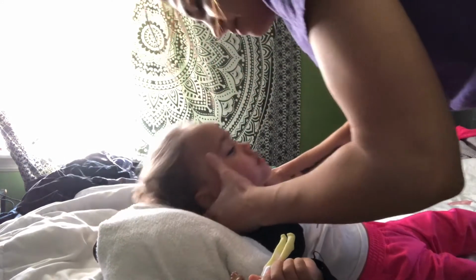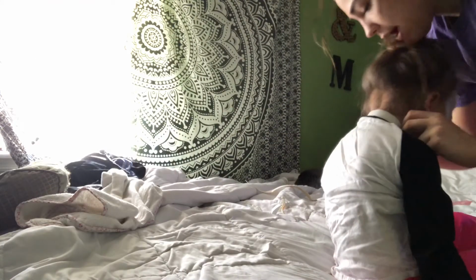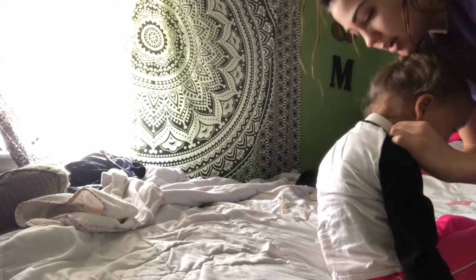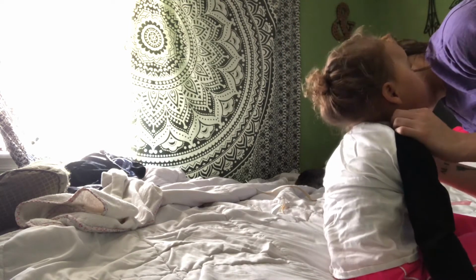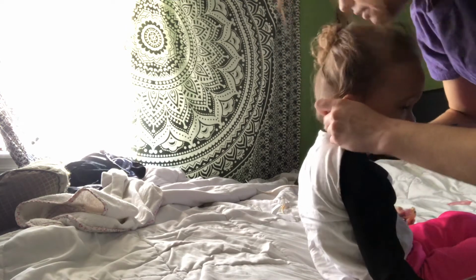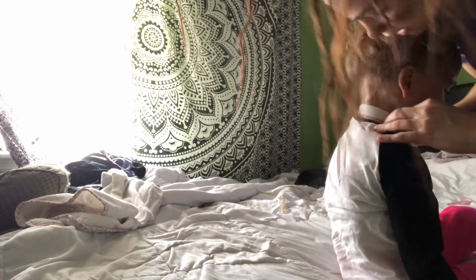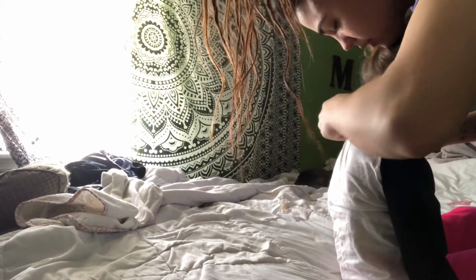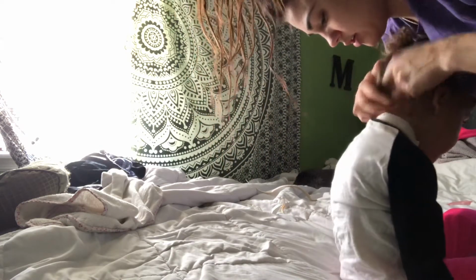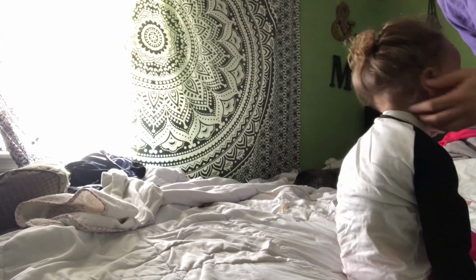Okay, now you sit up, up, up, up. And this is where I can have her look down to the ground, and adjust it. Up to the sky, up to the sky. It takes about a minute to make sure you have everything right. Hold on, look down to the ground. Down to the ground, 2 seconds. And make sure in the back that there's no excess, so it's not poking her.